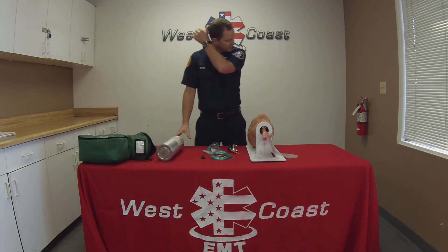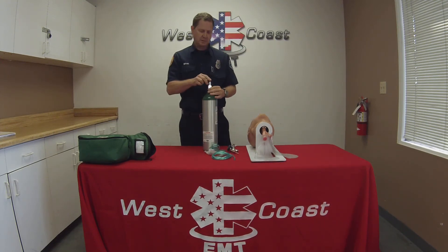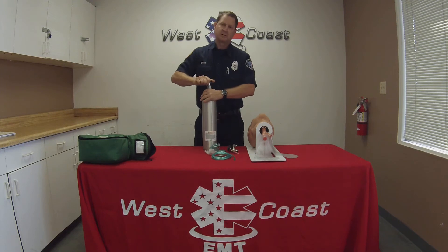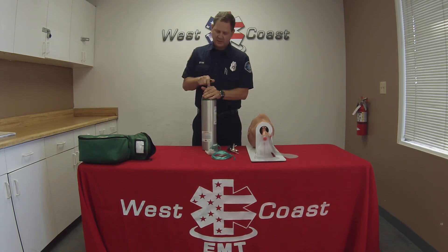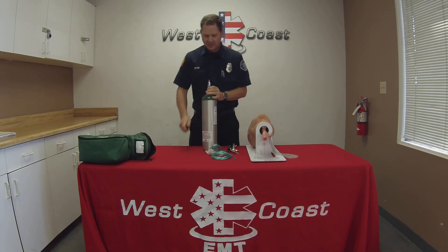Continuing with this skill, I'm going to go ahead and stand up my oxygen tank, crack it open, and clear out any debris that may be clogged in the port here.